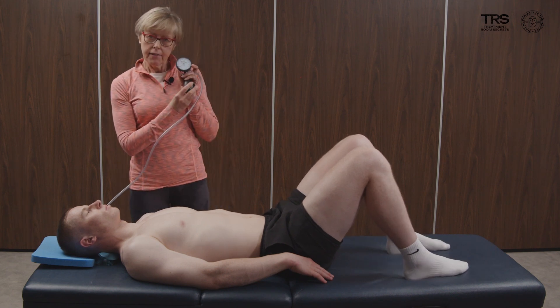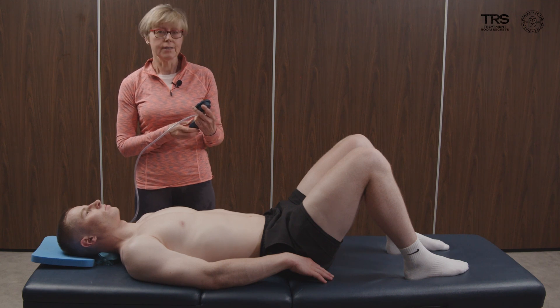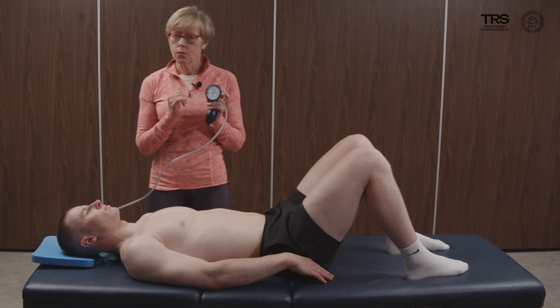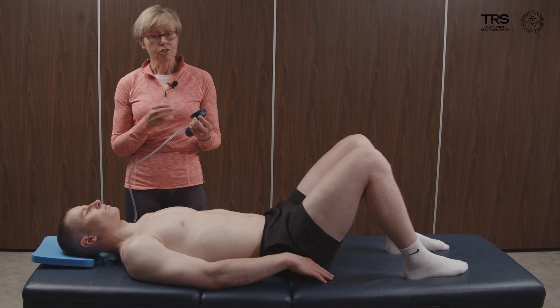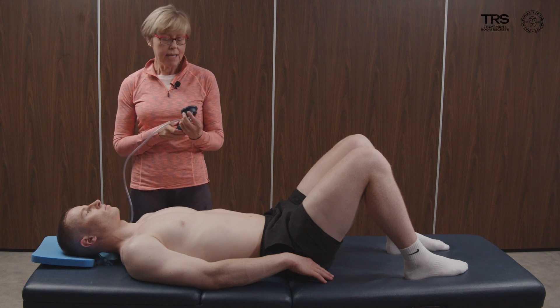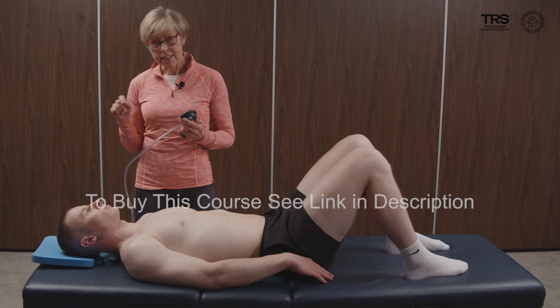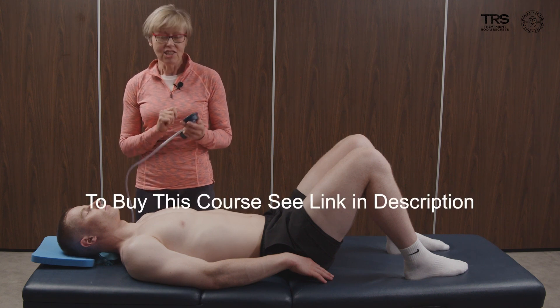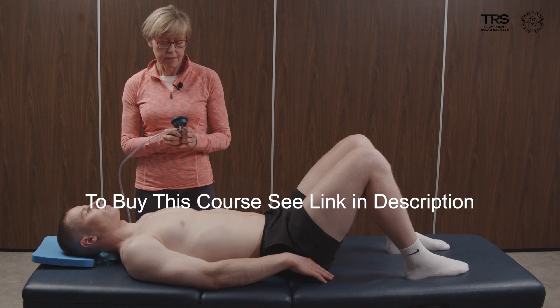Now if you haven't seen one of these before, they're really handy to have, so do go and rush out and get one. I'm going to position it with the needle at 20 millimeters of mercury to begin with, and then I'm going to instruct my client to make a cranial cervical flexion — nodding the chin towards the chest — and just notice what happens on this dial.